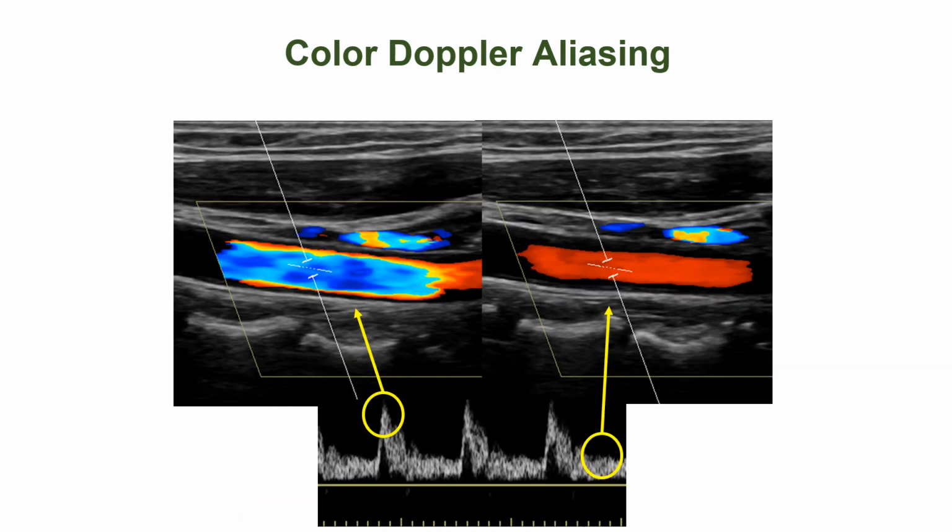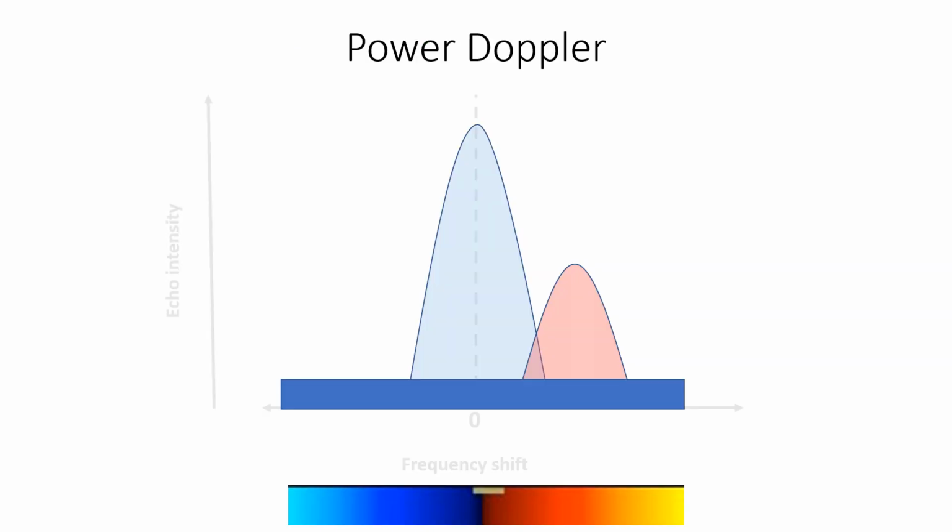Clinical interpretation of still color Doppler images is sometimes challenging. The appearance depends on the point when the image was frozen. It is always preferable to have a combination of color and spectral Doppler modalities rather than a color flow image alone.